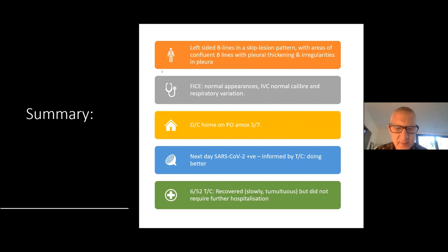This is a really nice case. There's a lot of discussion about initial COVID diagnostics, but here we're seeing a role in the follow-up phase — working out why someone is still breathless. I wanted you to notice the almost unilateral changes here, as often what I've seen has been bilateral. From limited experience, earlier in the course it tends to be asymmetrical and then spreads to become bilateral. It's really important to compare both sides.